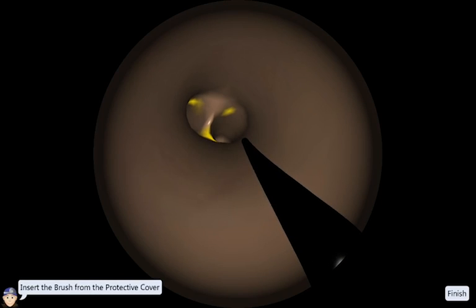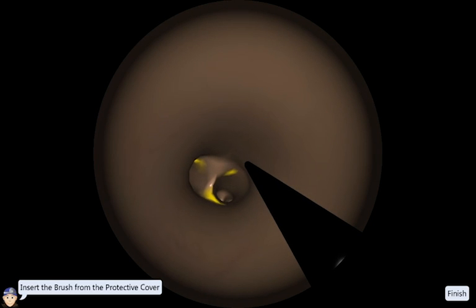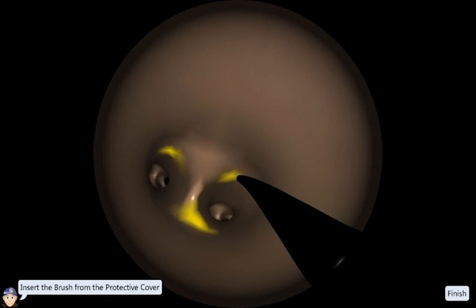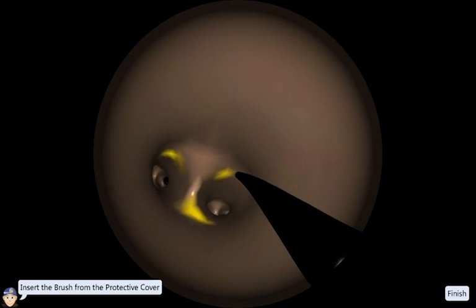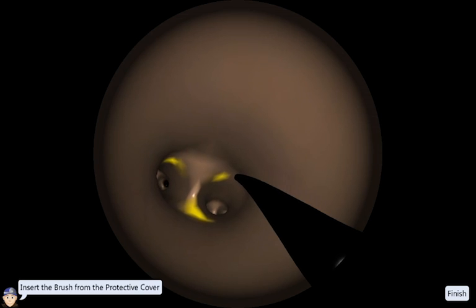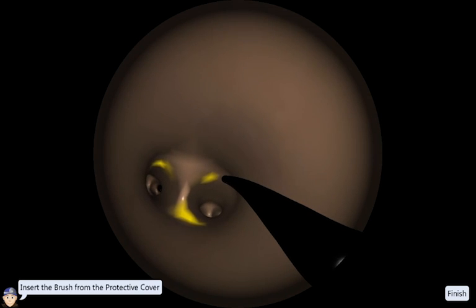Insert the cytology brush in the tool channel when the specific segmental bronchus has been reached. Make sure that the brush is protected during the insertion.